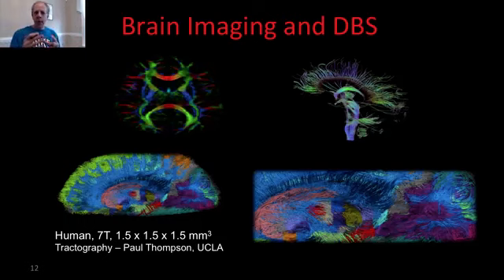What do I mean by that? You basically register them, you align them. We talked about registration when we were talking about HIV and image processing for viruses. So you put all of them in the same coordinate system. You might be able to bring the atlas as well if you wish to do so.